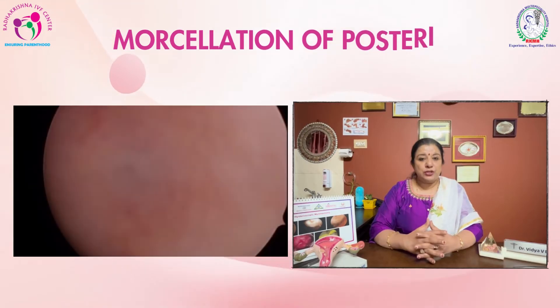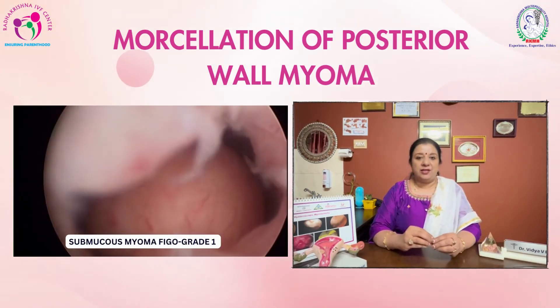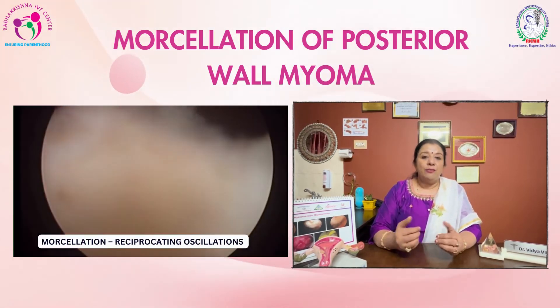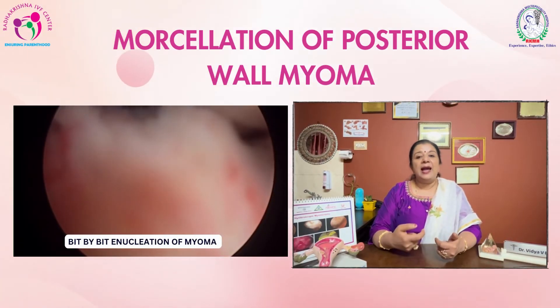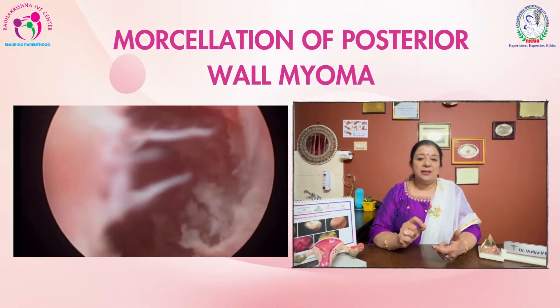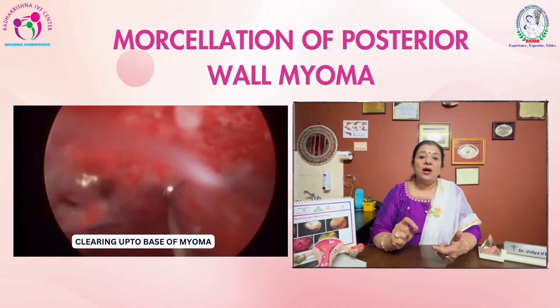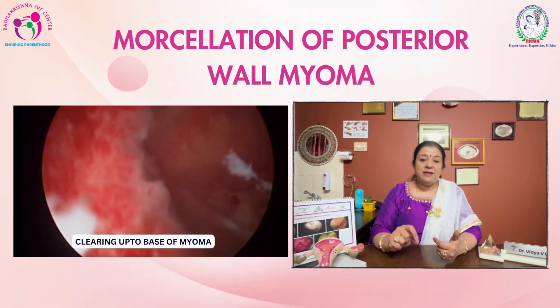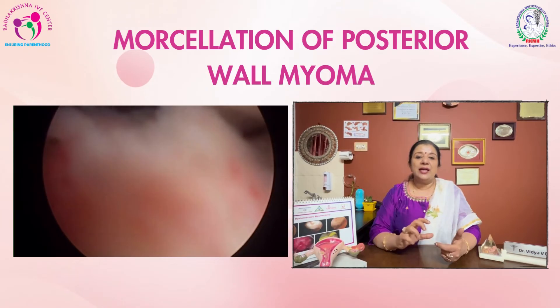This is the video which shows a myoma which is not exactly in the uterine cavity but just above the internal os. With the conventional method, if you try to do hysteroscopic myomectomy, the water or fluid will leak, there is a lot of discomfort during the procedure, and bits float inside the uterine cavity. We are doing this with the morcellator and see how beautifully the procedure is done. At the same time you can do a visual DNC — that is, you can take the endometrium for biopsy — and you can see that the myoma is completely removed and you get a very nice uterine cavity.